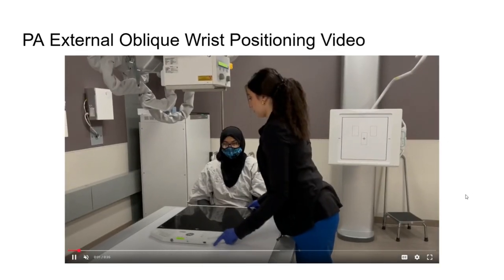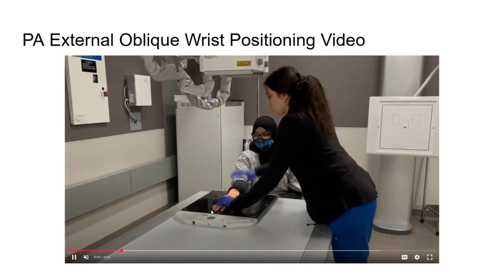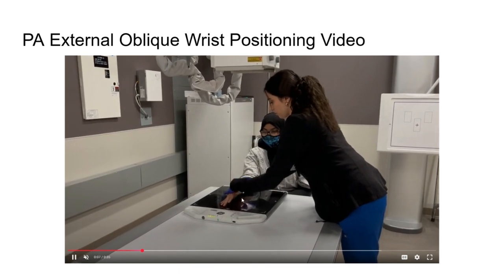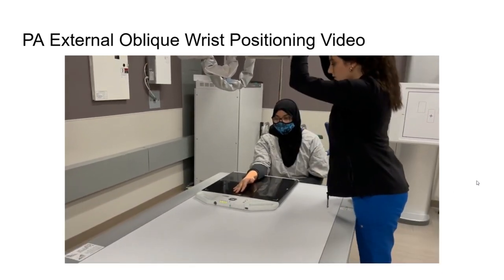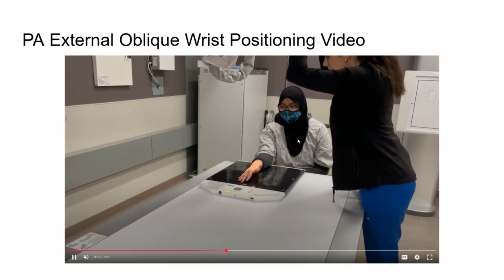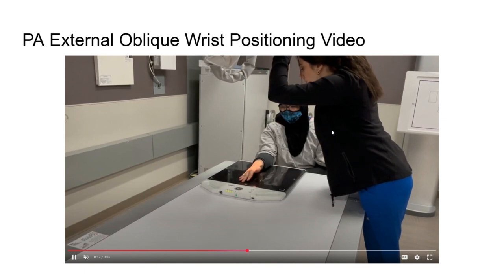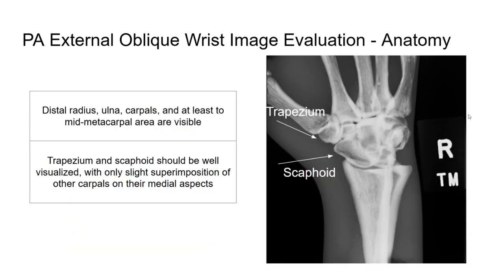Now, Selena once again was showing how to do this on Tuba. As you can see, Selena does a little bit of obliquity and then she puts her hand there just to make sure she's not overdoing it. But as I said, she's good at what she does. I don't need to go over everything. We know she can take x-rays.